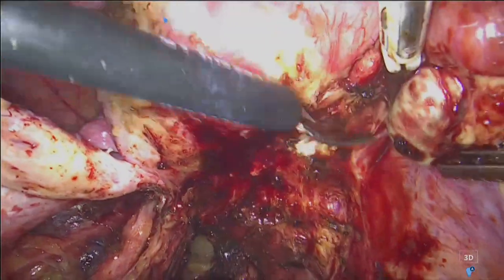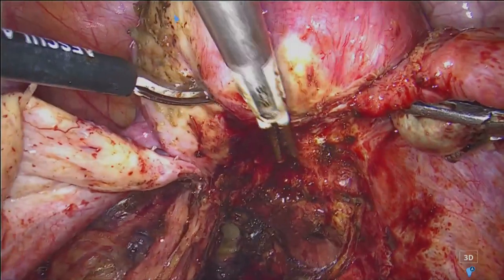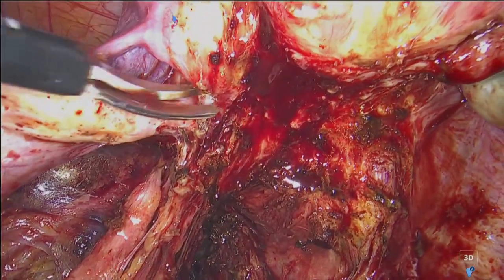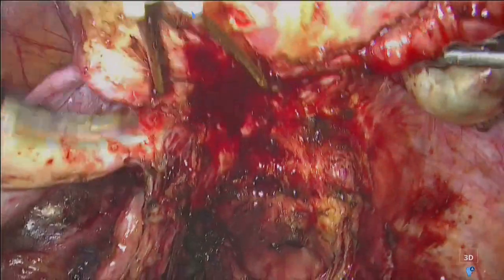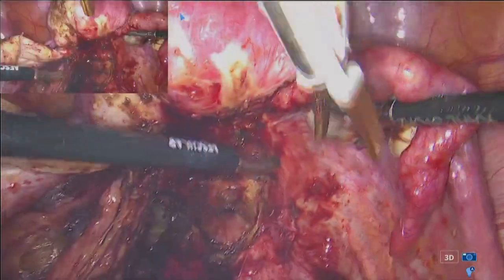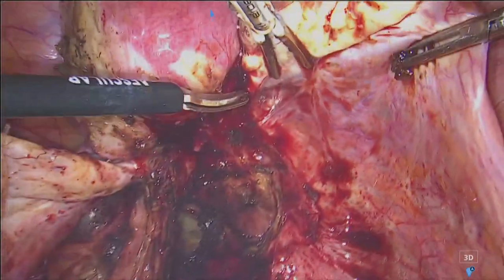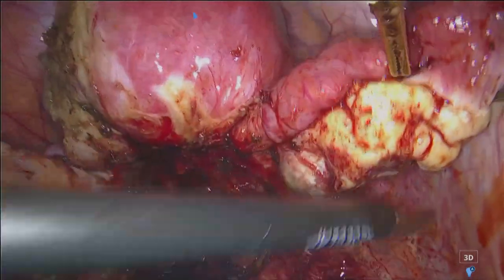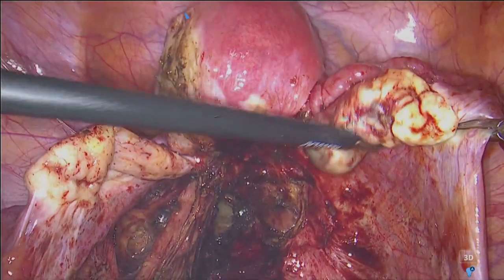Okay, so you see that Dr. Lucia Casarella pushed the ovary laterally. This is the small confirmed endometrioma of the right side. Going here, we increase the movement of the uterus. We arrive at the level of this plaque here. And we can put probably another lift on the right ovary. Now the right ovary is outside. Okay, I try to put this here in the normal tissue, and then we open the small endometrioma and we treat with the laser.